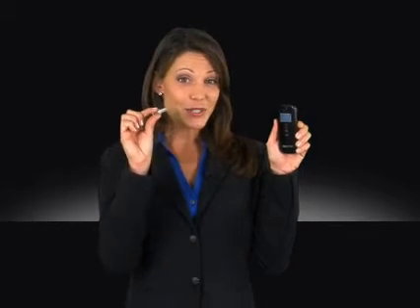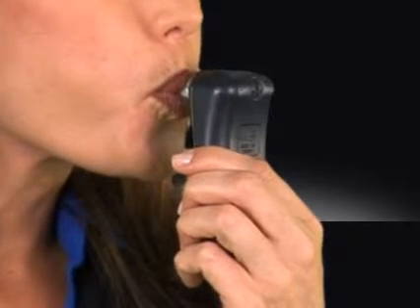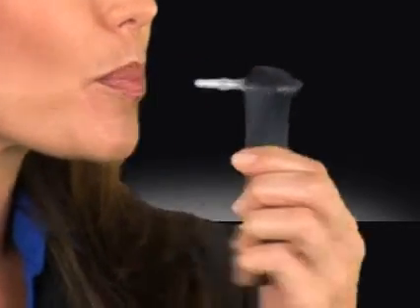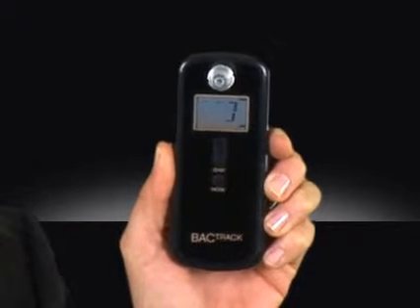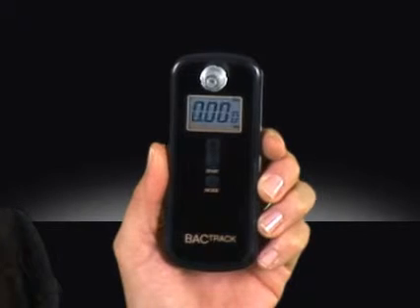Yet it's one of the most affordable and easy-to-use breathalyzers available, making it perfect for personal use too. To test with the S75 Pro, simply insert the mouthpiece and blow for 5 seconds. The counter will tell you when to begin and stop, and your results will appear instantly on the screen in front of you.